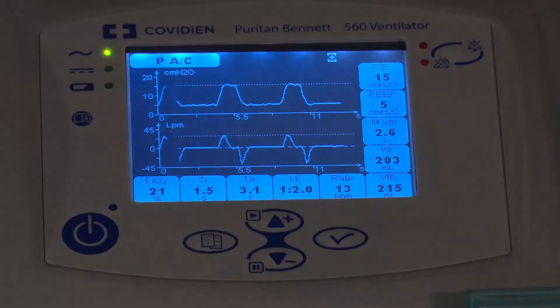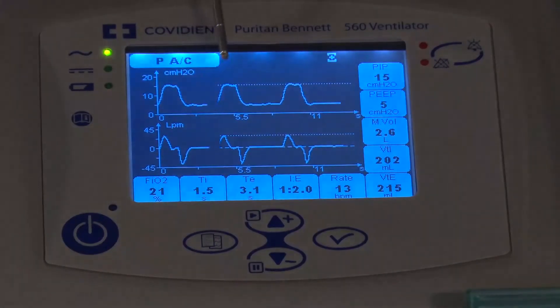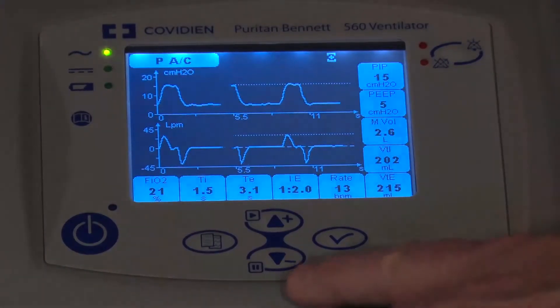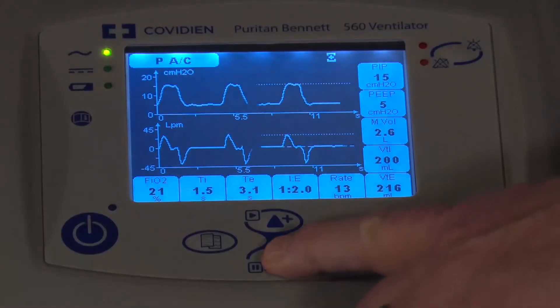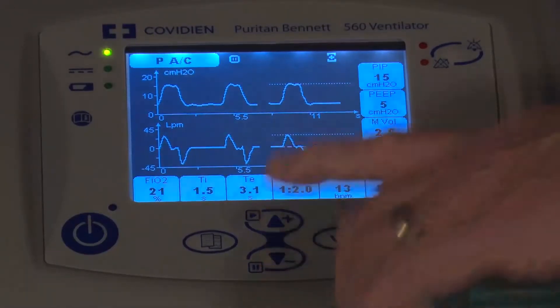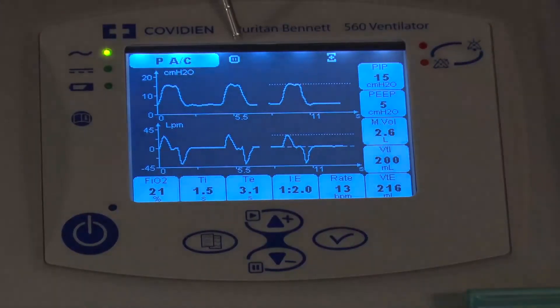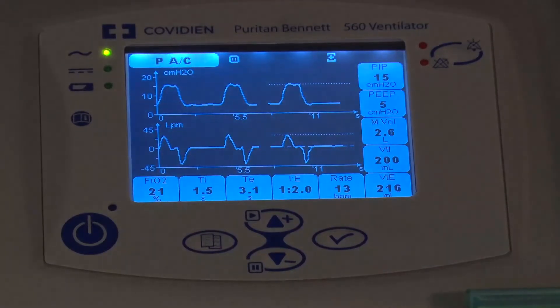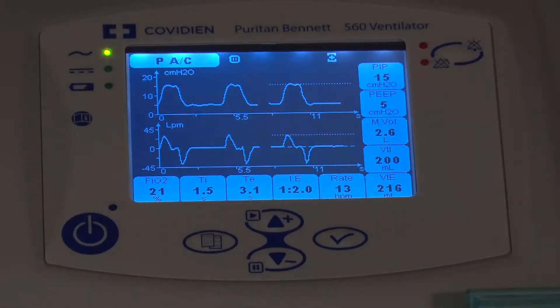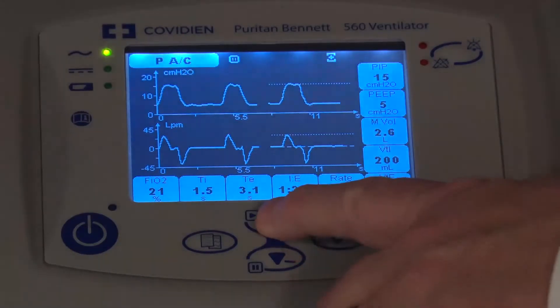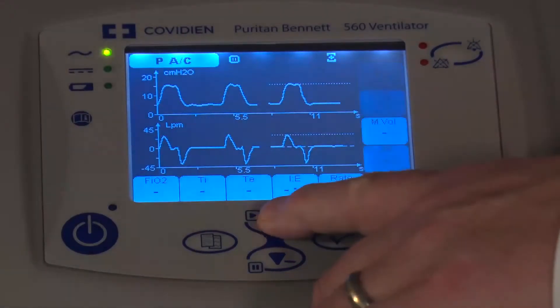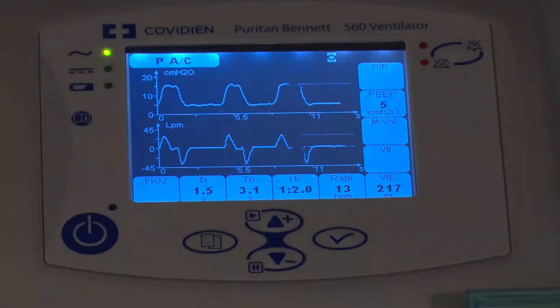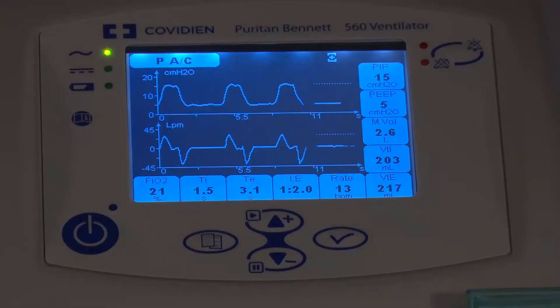If you want to do something with the waveforms and you want to freeze the waveform, there is also a dual function key down here. If I just push that, you'll see a freeze button comes up here on the top and I actually freeze my waveform. To get out of that, I can simply just push — unfreeze is the top arrow — and then the waveforms begin to display again.